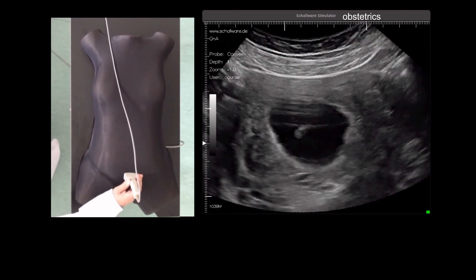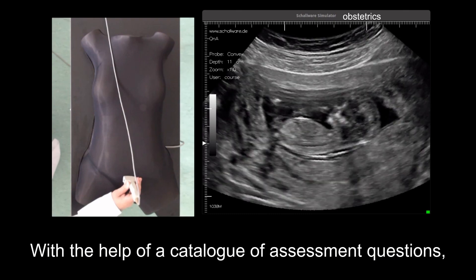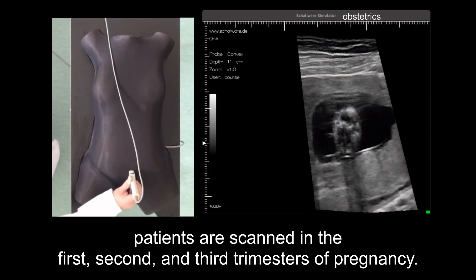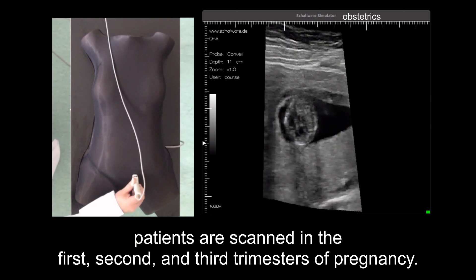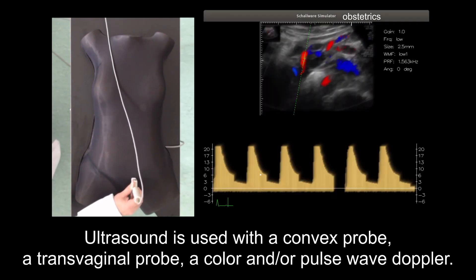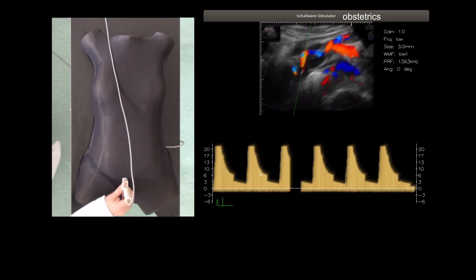Obstetric assessment question: with the help of a catalog of assessment questions, patients are scanned in the first, second, and third trimesters of pregnancy. Ultrasound is used with a convex probe, a transvaginal probe, and a color and/or pulse wave Doppler.